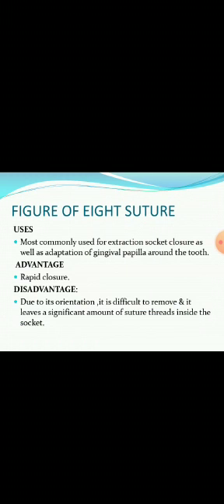Figure of 8 sutures. It is commonly used for extraction socket closure, such as adaptation of gingival papilla around the tooth. It provides rapid closure, and due to its orientation it is difficult to remove, and it leaves a significant amount of suture thread inside the socket.